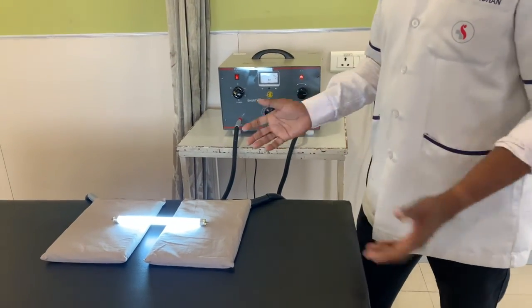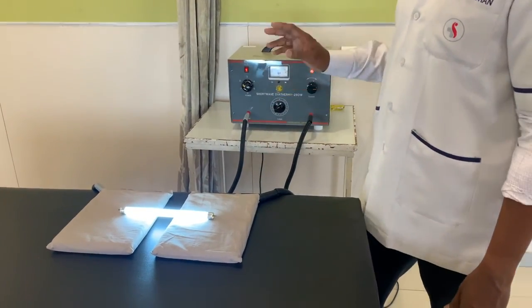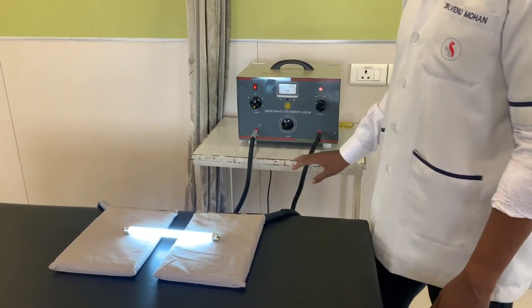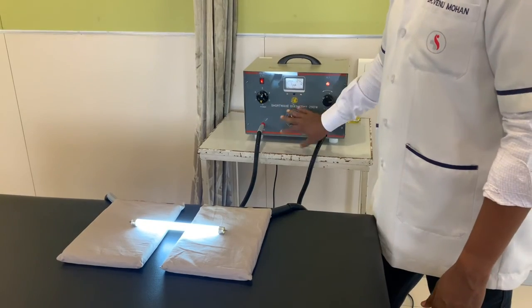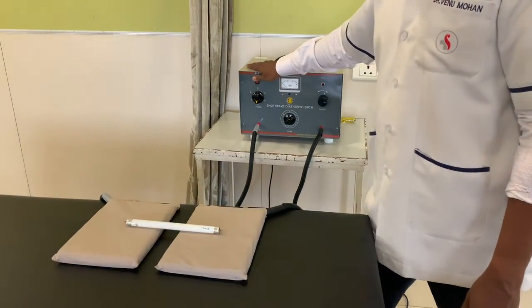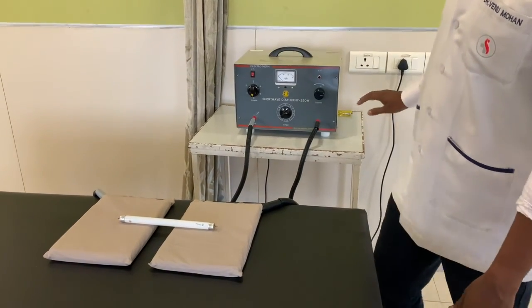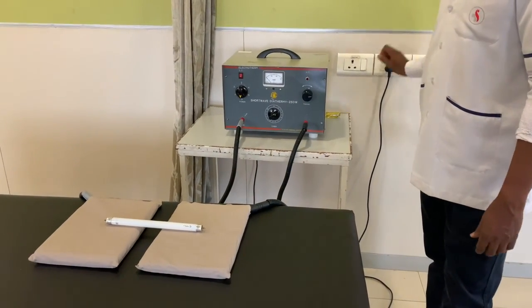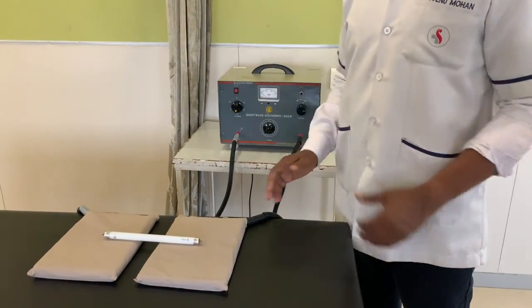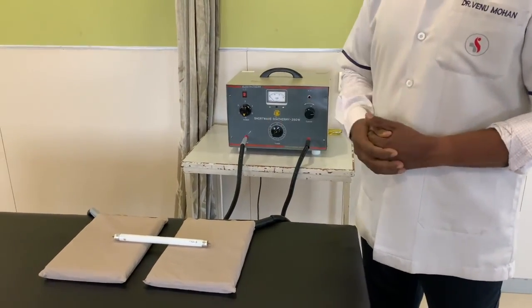Next part is winding up. For winding up, we have a procedure. What we do is we bring the intensity to 0. Then we don't bring the timer to 0 as it is spring based. Then you can switch it off and finally switch the power off. This is the procedure of winding up, and you can replace all the items back to the cupboard.